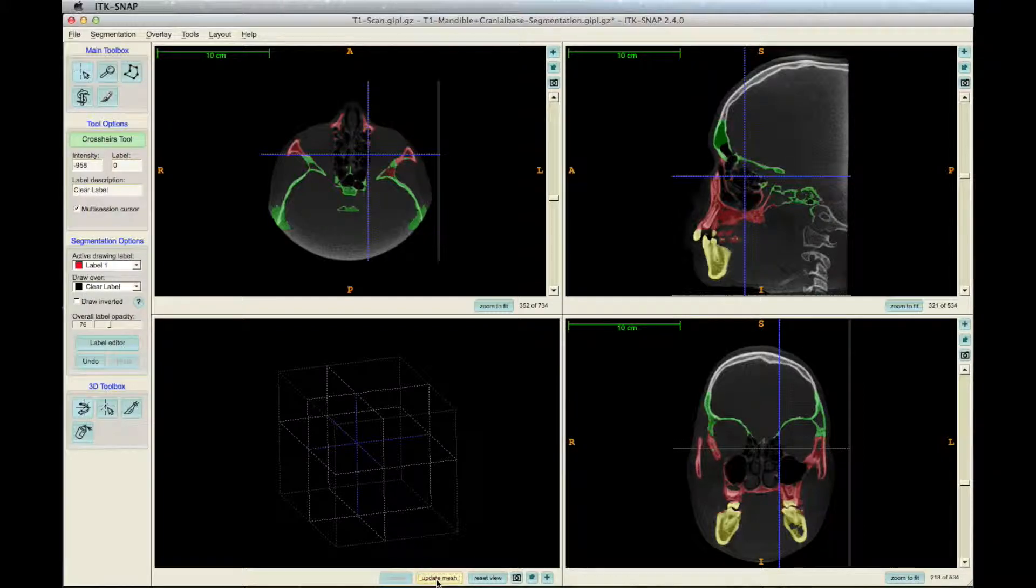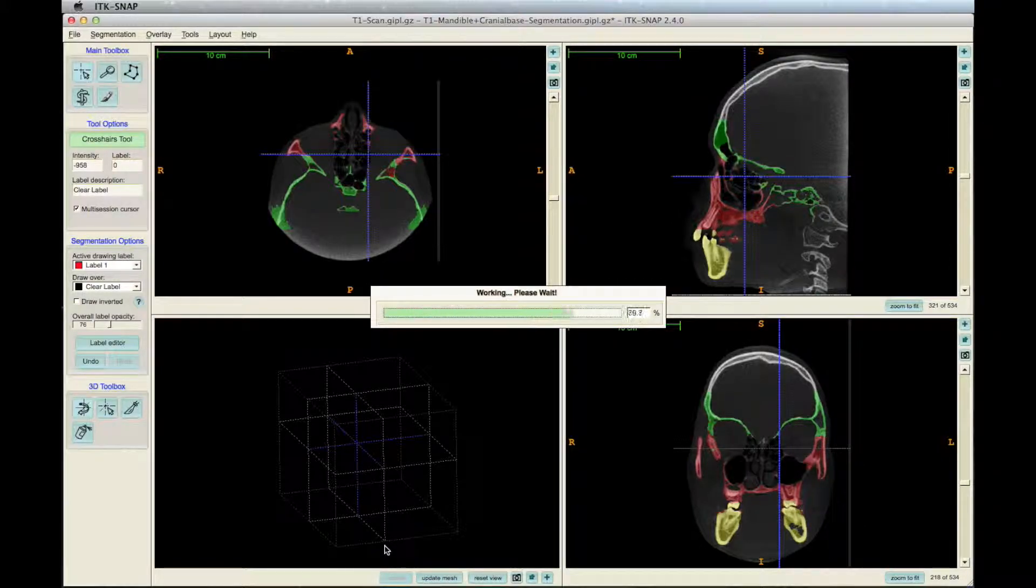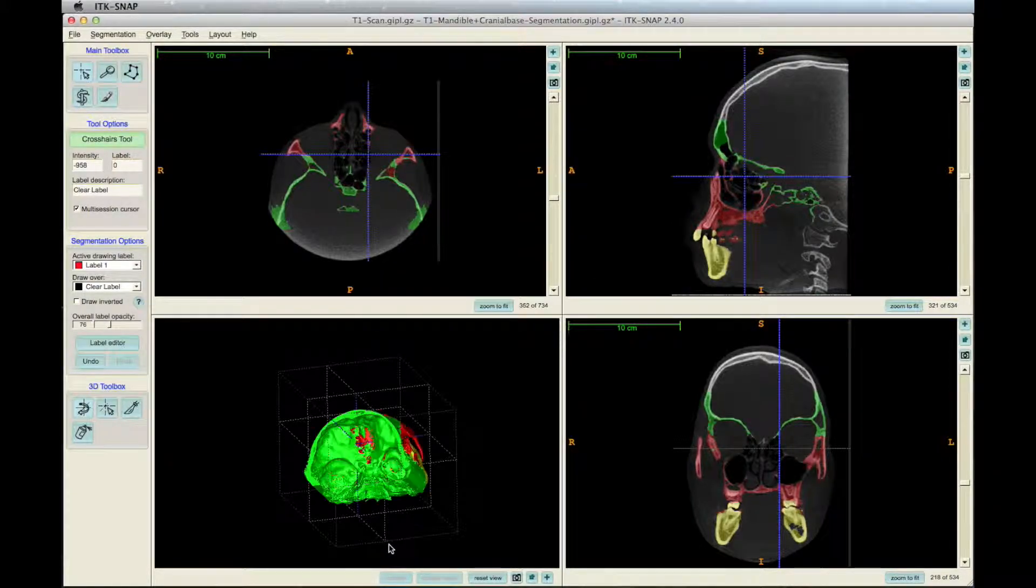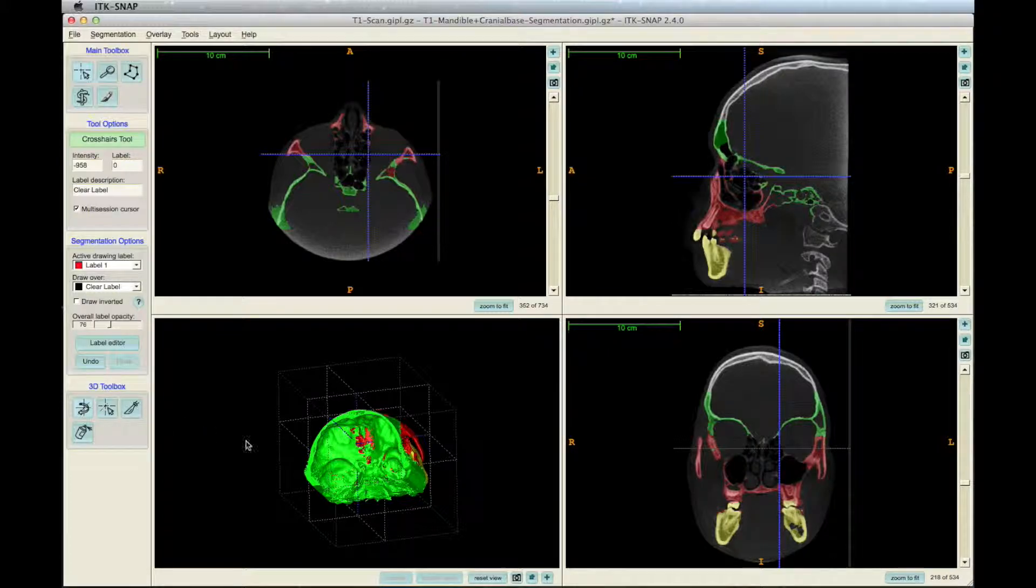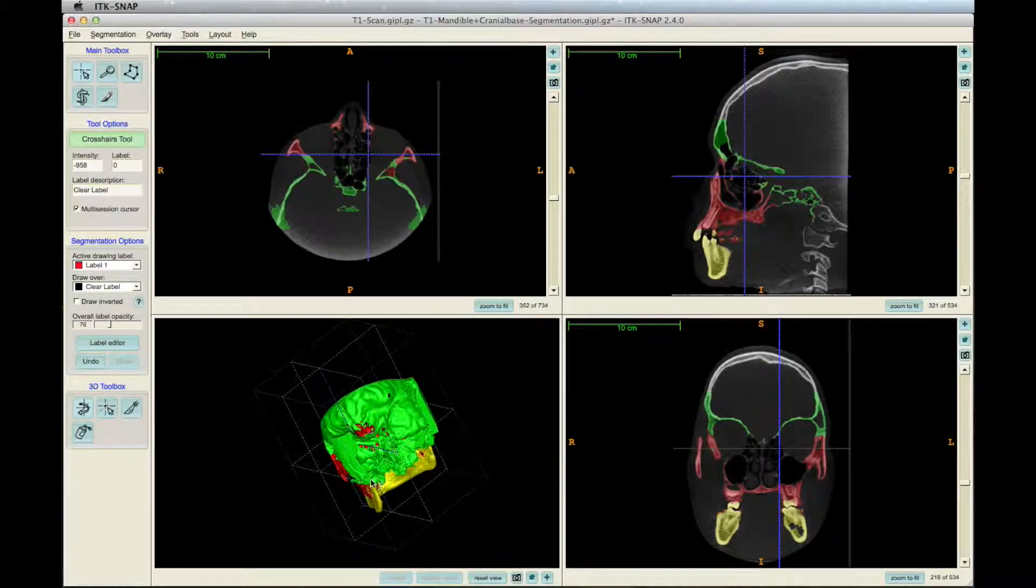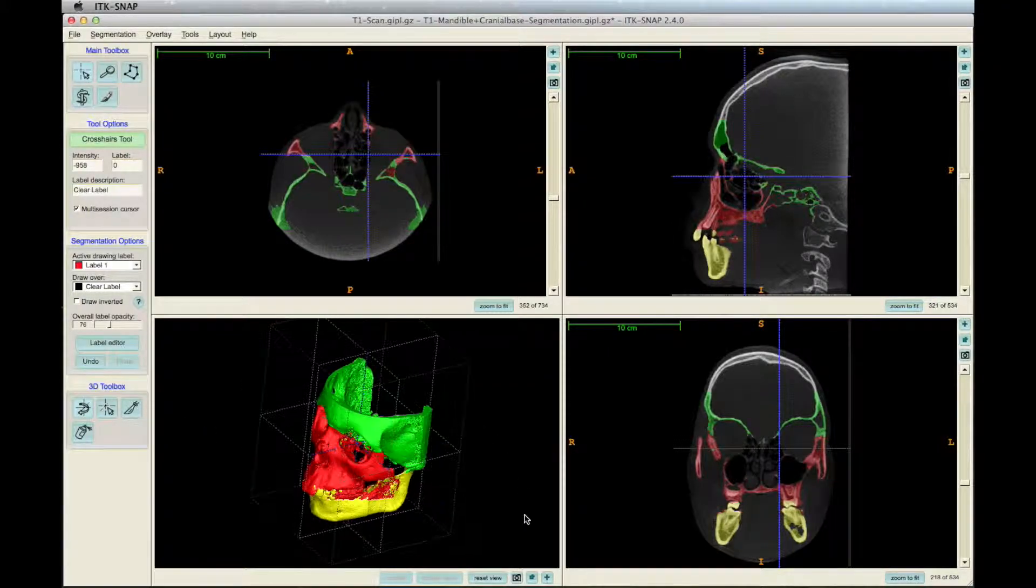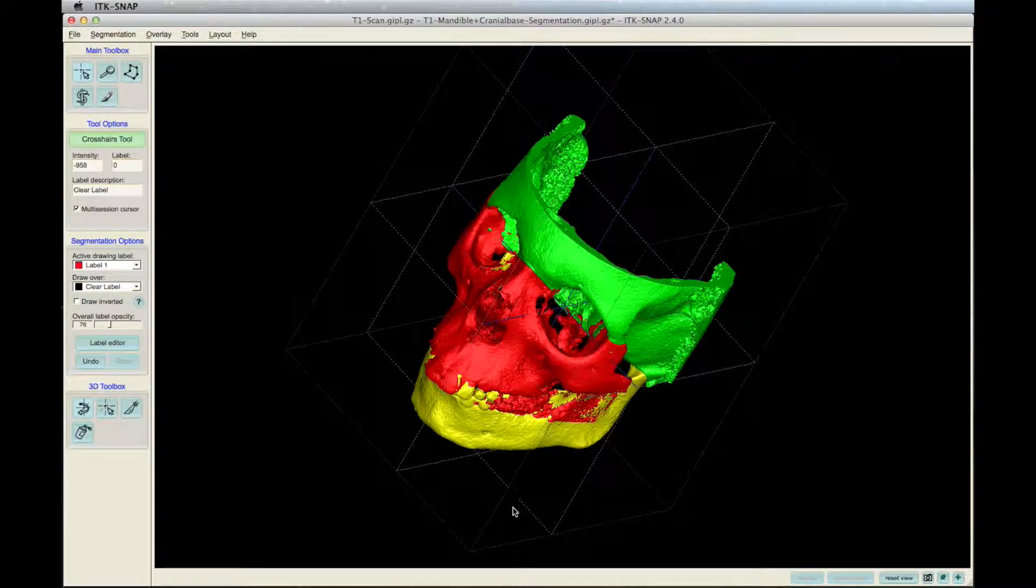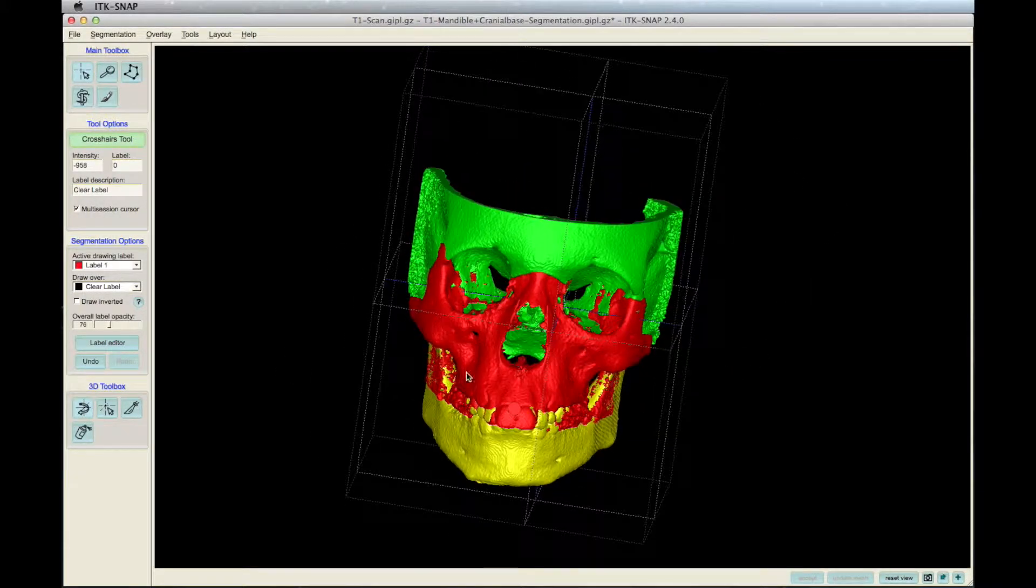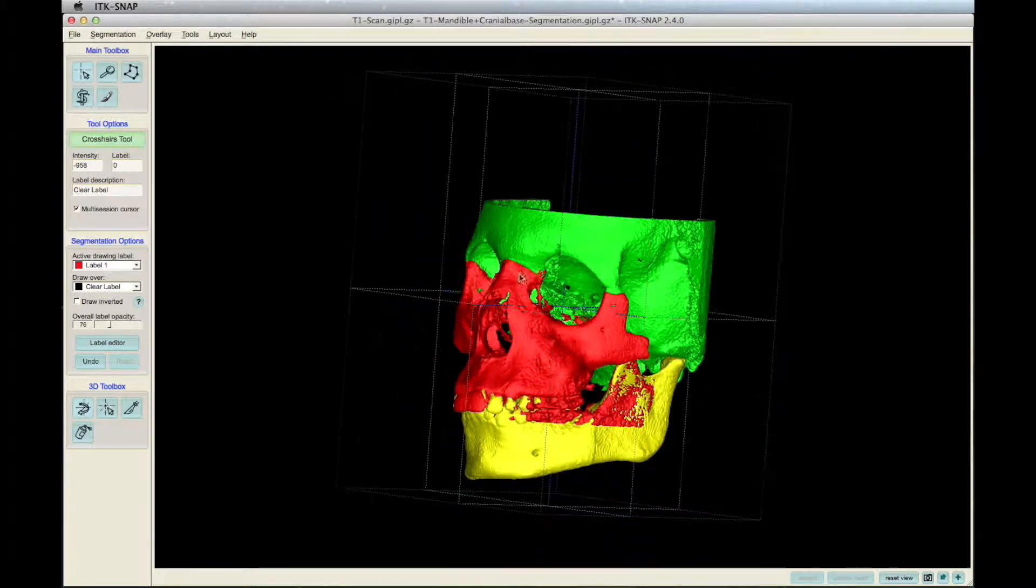Click Update Mesh to see the final segmentation. Here, the mandible had some deformities, so it'll need adjustments with the paintbrush.